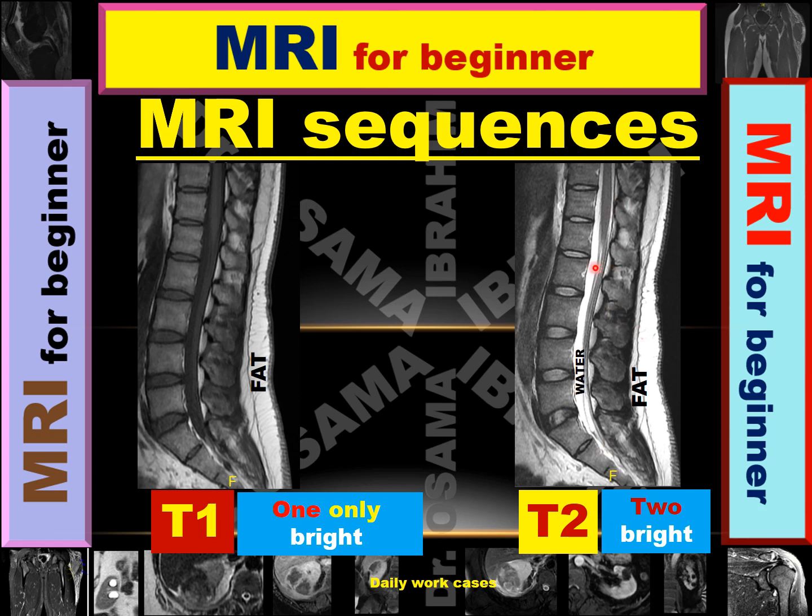Comparing with this T2 sequence, which shows high signal of both fat in the subcutaneous tissue and also water in the CSF space. So high signal of both fat and water means this is T2 signal. In other words, if there are two bright, fat and water, this is T2. If only one is bright, fat only, this means T1. And this is the difference between T1 and T2.